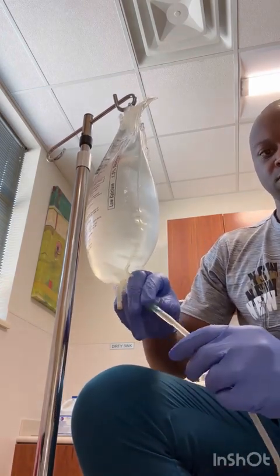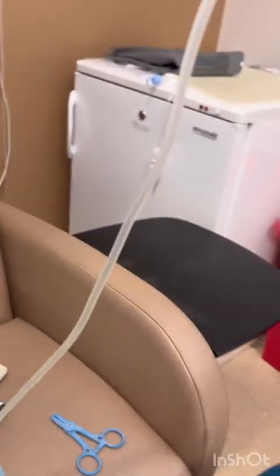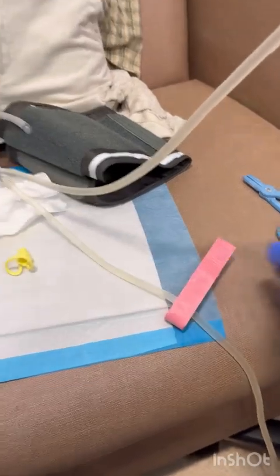When I take that clamp off, the fluid is going to rush out, pushing that air into the drain bag. One, two, three — clamp, clamp, clamp. That fill line is now filled with fluid, no air, and we can open up that transfer set so Steve can get his prescription, his dialysate fluid.